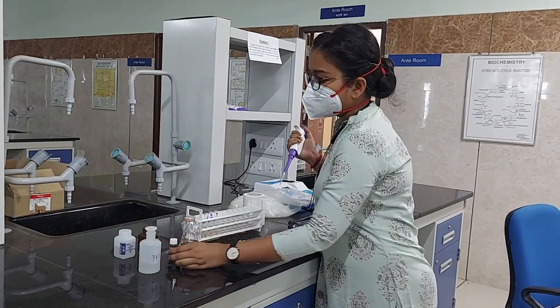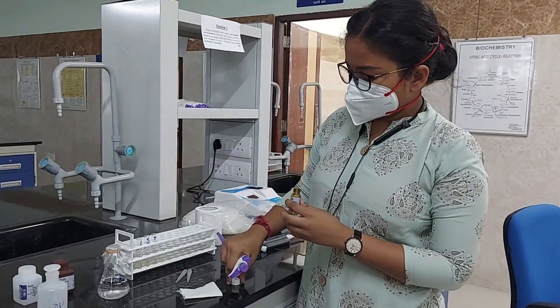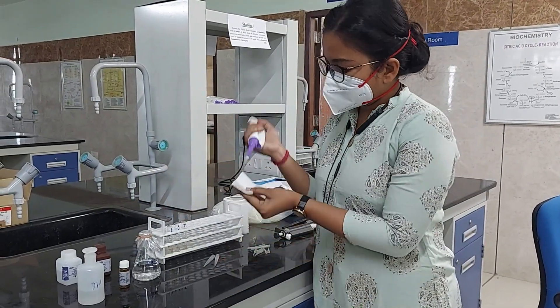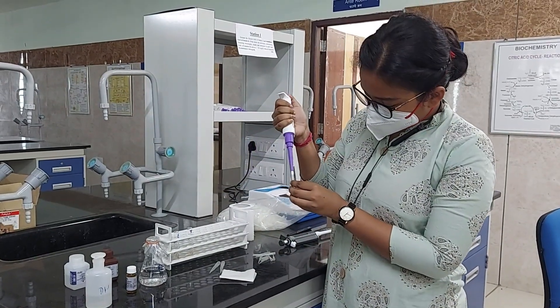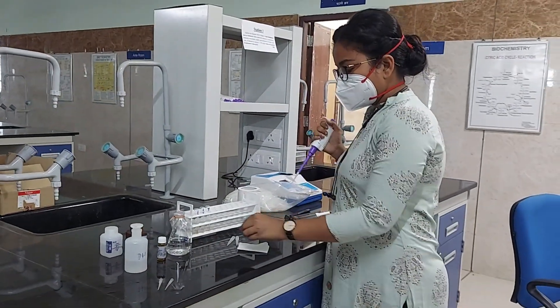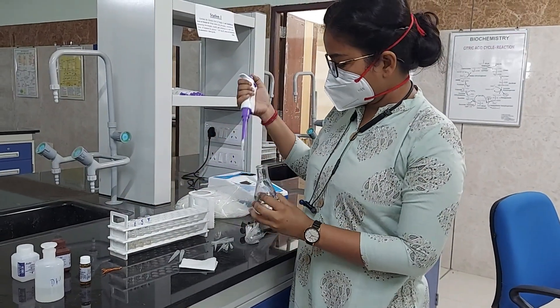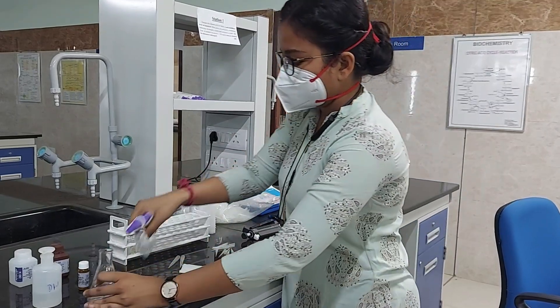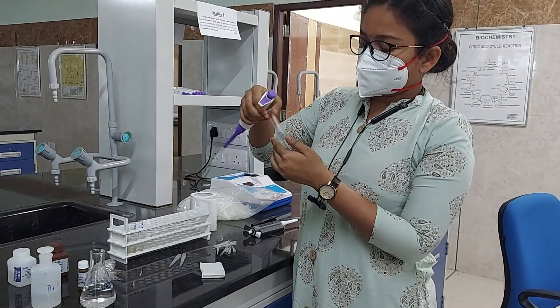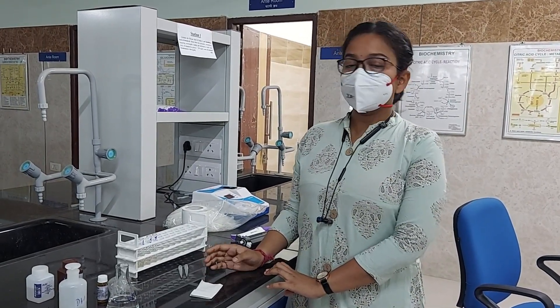Again, take another tip and I am taking a standard solution and adding it to the standard marked tube. Mix it well and discard the tip, picking a fresh one. Now we have to keep these 3 test tubes at 37 degrees centigrade in the incubator for 3 minutes.